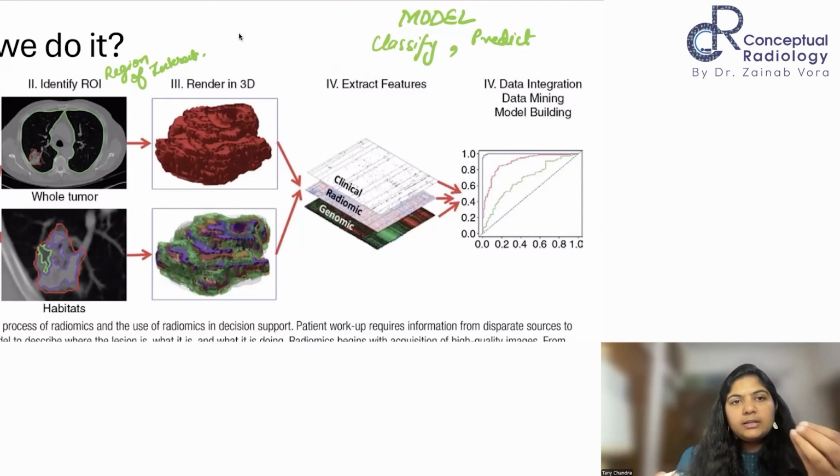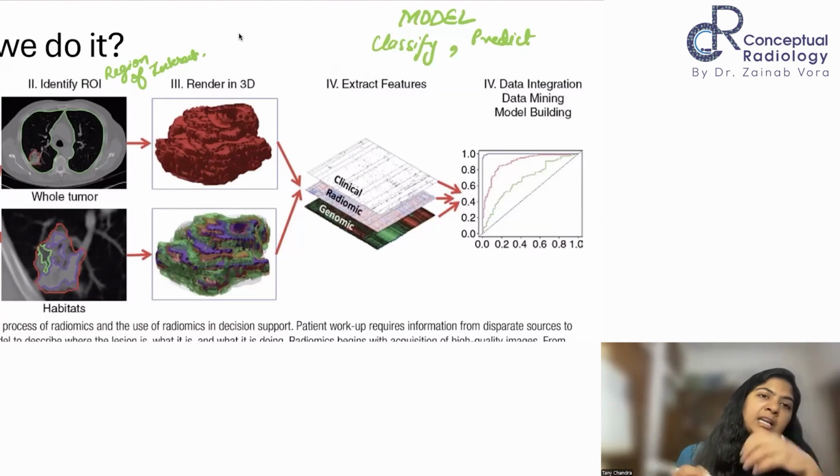So you can predict, you can classify, right? So classification can have multiple ways. It can tell us the diagnosis of the patient, right? I can ask it to classify whether it's a lung CA or it's TB. Then it can help us diagnose, right? Then I can ask it to classify whether this patient is going to improve or not improve, so it can prognosticate.